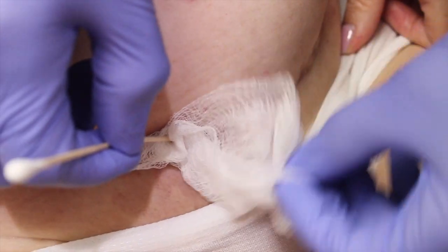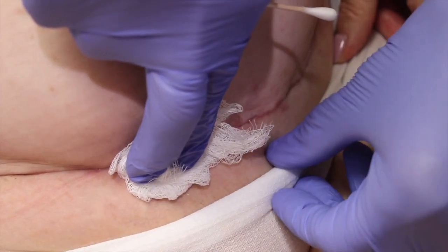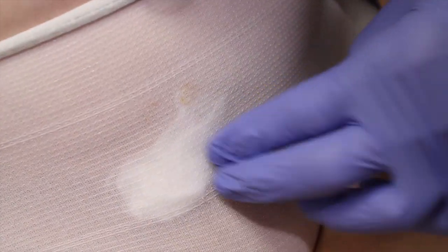The dry part stays on top. You can hold it there with a piece of tape — I prefer just to use underwear. You just pull it up and the patient changes that three to four times a day. Before you know it, that hole will be healed.